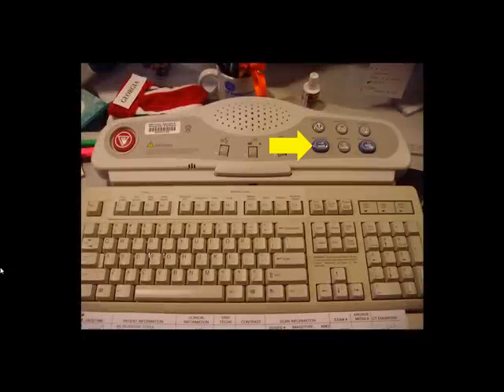And then you'll look at your keyboard. You're going to move the patient into position with this button, and you're going to start your scan with this button. Now to view the images, you want it on abdomen. And you're going to use the move to scan and the start scan buttons for each scout. Once you have your scouts, this screen is going to pop up. This is your procedure screen.